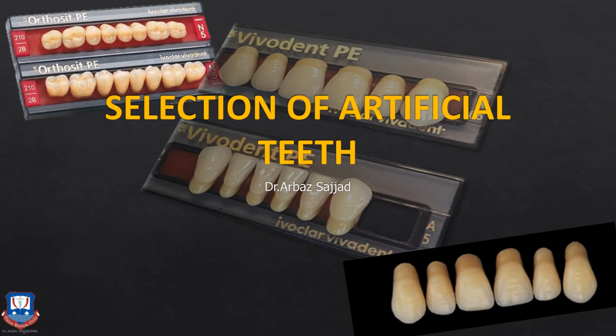The topic of this lecture is selection of artificial teeth, and we have covered previously articulators. Before that, we covered maxillomandibular relationship. Before that, we covered orientation jaw relationship. So now, once the upper and lower casts have been mounted and correlation has been done, we accomplish the teeth setting.